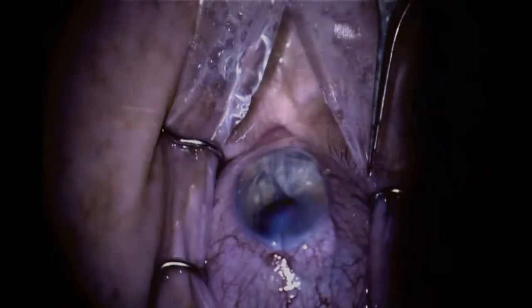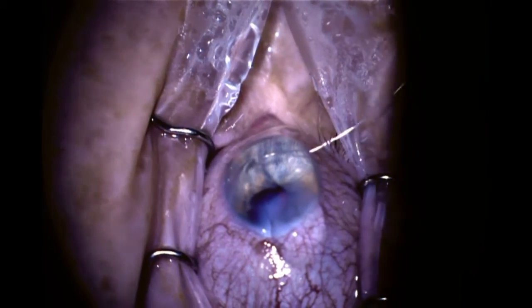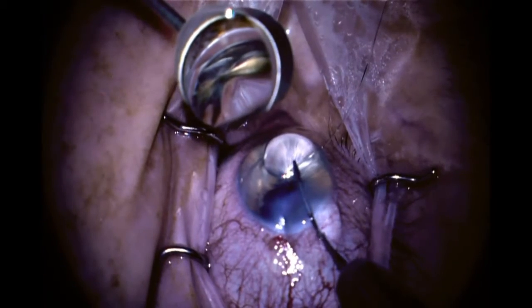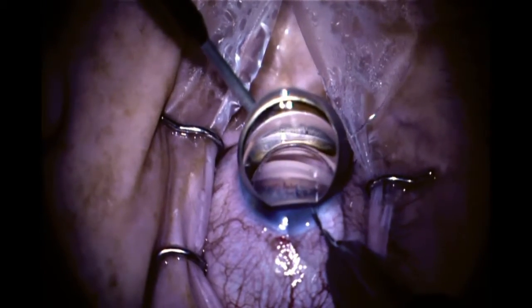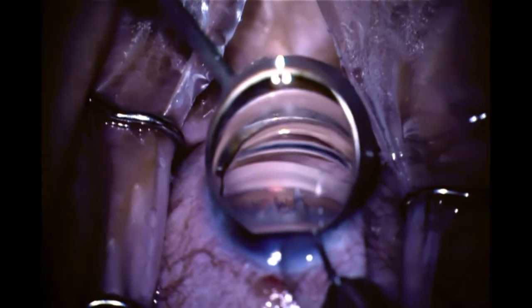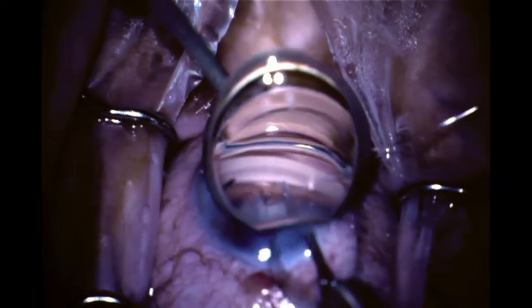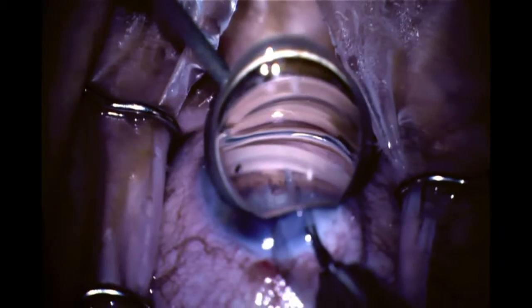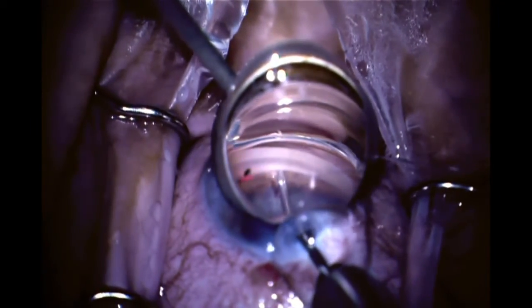We then take this illuminated microcatheter, which contains within it a small lumen that allows us to later inject viscoelastic into Schlemm's canal. You can see that I begin directing this illuminated microcatheter into Schlemm's canal, and I want you to pay attention to the angulation outside the eye. I'm getting a lot of resistance going within the goniotomy and I notice it's deflected upwards — not in the same orientation as my original paracentesis. So I ask my assistant to bring it down towards me so that it's following the same tract, and then I'm able to advance it much more easily.